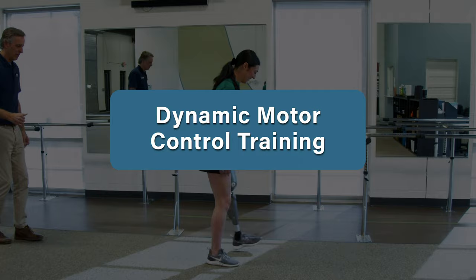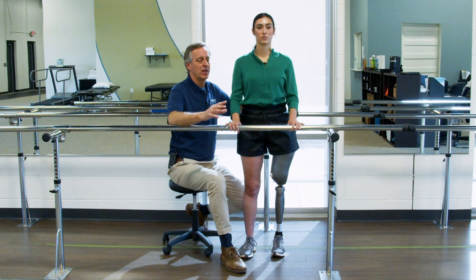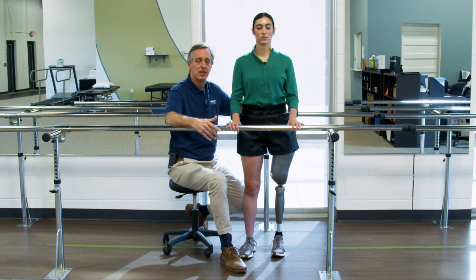So now what we're going to look at is sidestepping and some dynamic balance drills. These are really important. Most times people think, well, I just want to walk. You realize that a big portion of what we do in life is not walking straight ahead. It's sidestepping, it's turning, it's moving in different directions. And the vast majority of falls occur not in the middle of walking. They occur in the middle of turning or sidestepping or getting off balance. So we want to work on this idea of not just walking straight ahead all the time, but also sidestepping.